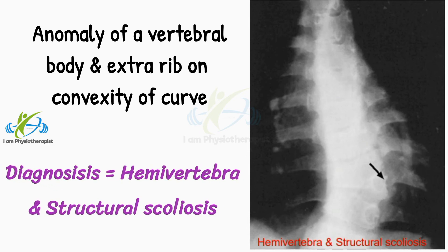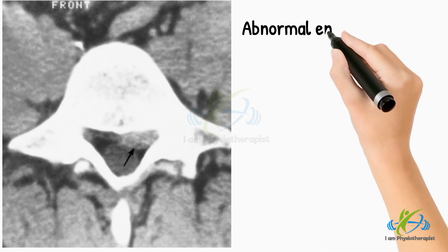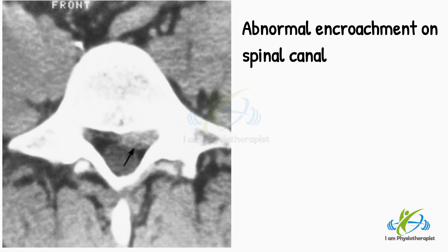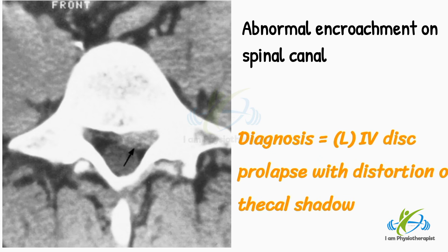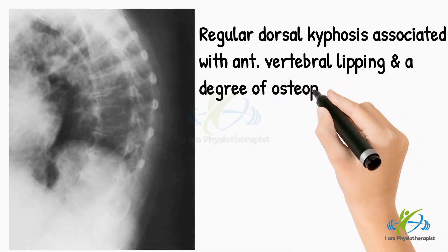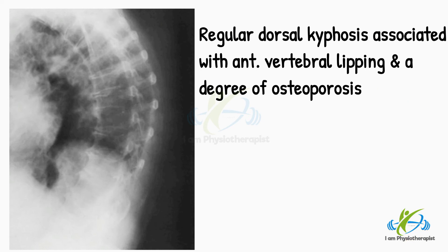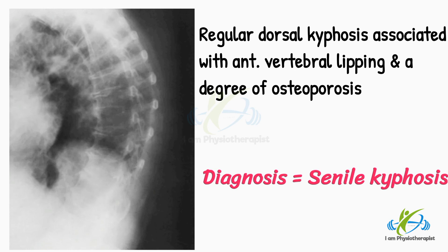Diagnosis is hemivertebra and structural scoliosis. This CT scan shows an abnormal encroachment on the spinal canal. Diagnosis is left-sided intervertebral disc prolapse with distortion of the thecal shadow. This radiograph shows a regular dorsal kyphosis associated with anterior vertebral lipping and a degree of osteoporosis. Diagnosis is senile kyphosis.